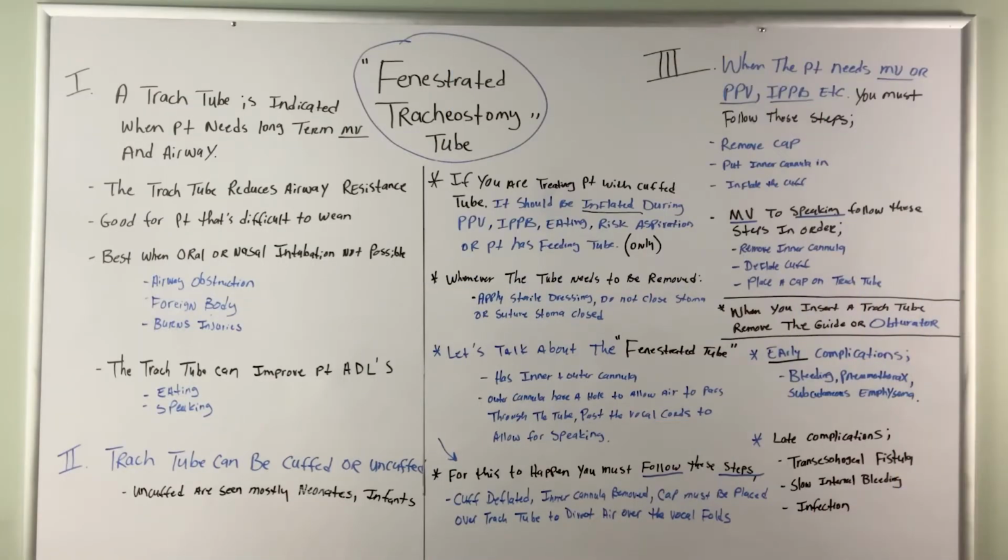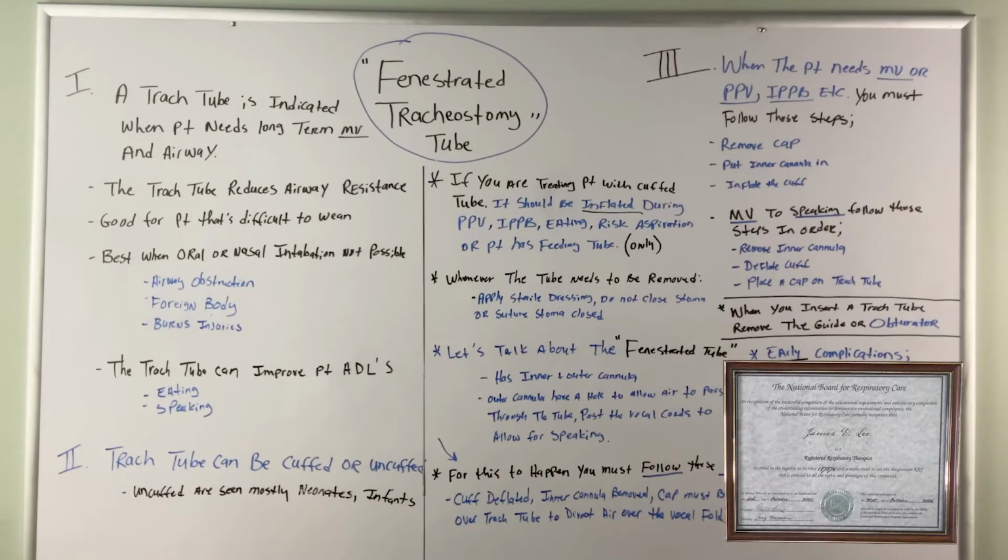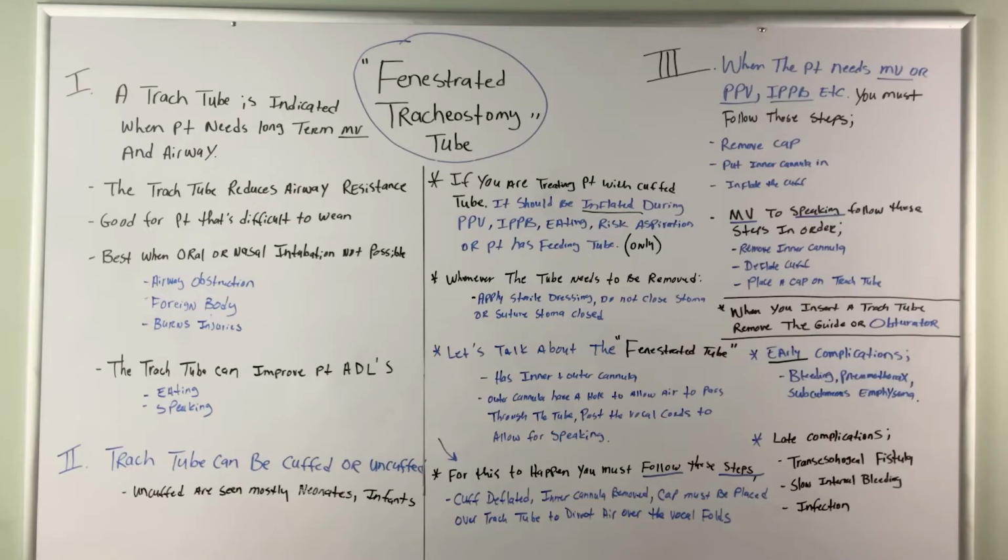Okay guys, I'm back, and tonight we are talking about the tracheostomy tube, and in particular the fenestrated tracheostomy tube. I want you to know that when you're taking the exam, these are the type of things that can sneak up on you, because you tend to study a whole lot of the other information, but this is specific information that I know you can appreciate. All right, let's go over them.